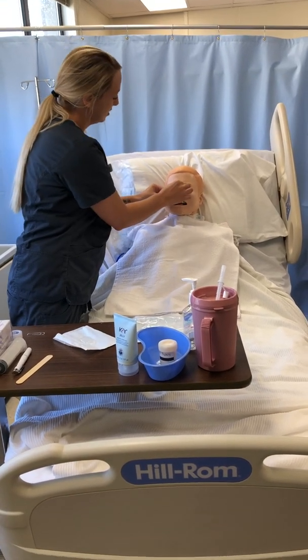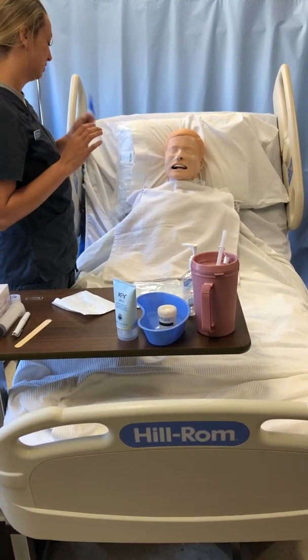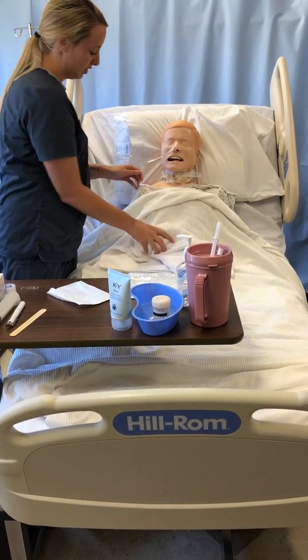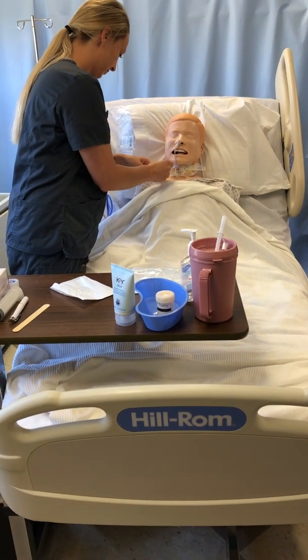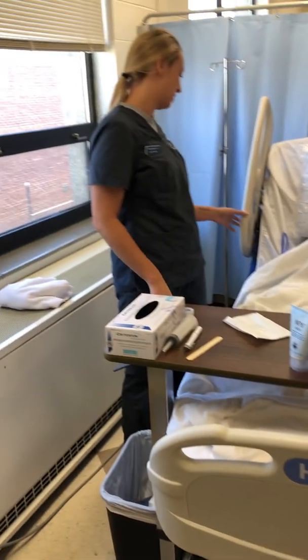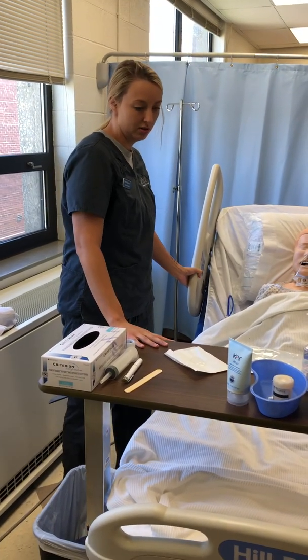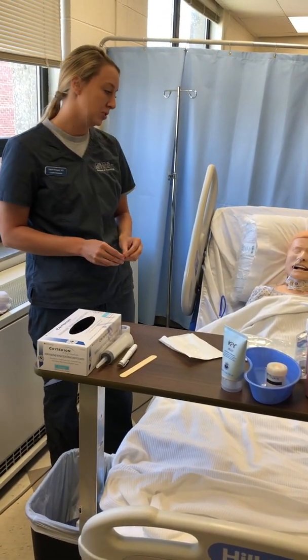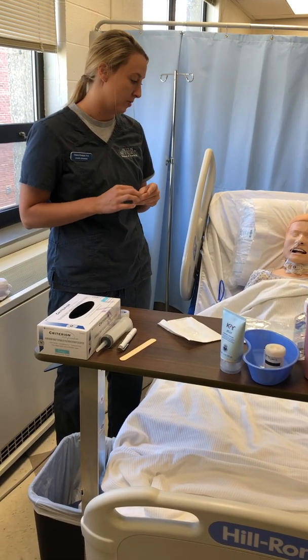Once you have it secured, then you can either hook it up to suction or clamp it, whatever the order says, or to a feeding. And then you also want to secure it to their gown with the safety pin. And then you would get your patient comfortable, lower the bed, give them their call light. And then you would assess or document how the procedure went, what type of tube you used. If there was any output, you would document that and how the patient tolerated.